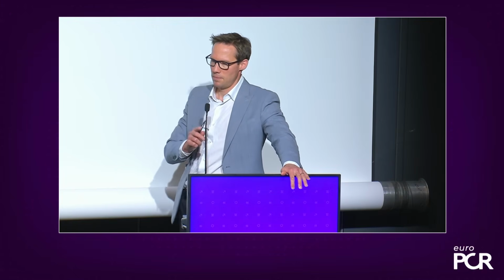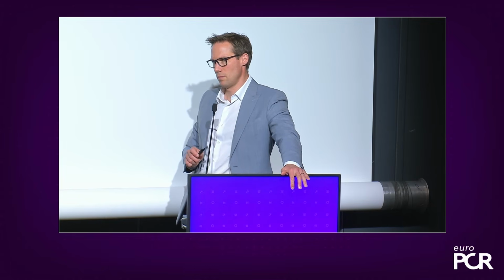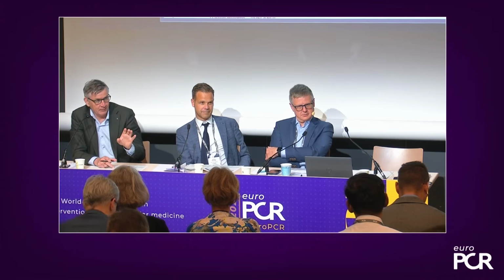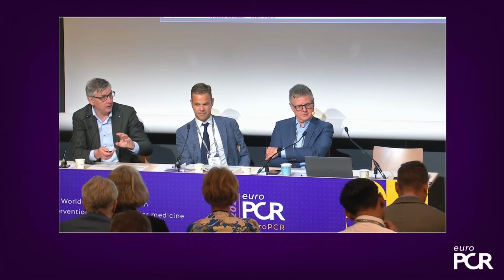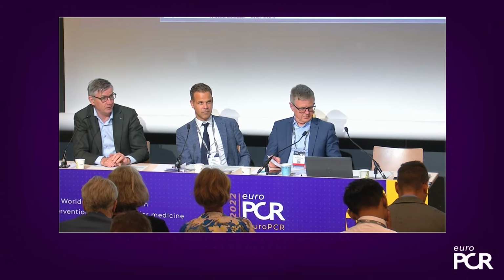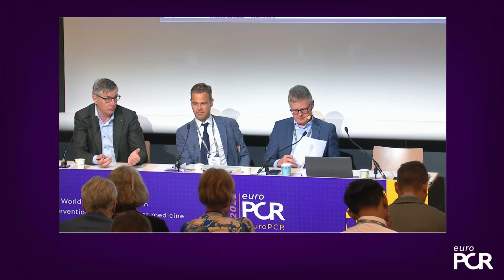So when we get at 6, there will be commissural alignment in 90%, something like this? 80% of the patients. 20% will still have severe commissural misalignment. And that's why when you have this CT information, you can actually adjust it. You can have this fine-tuning for each specific patient. Everything told you in your pre-procedural tremendous workup.